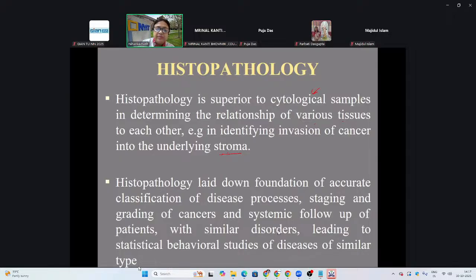Staining a tissue is a much more complicated process, and that requires several more intricacies in order to be able to look at the tissue as such, or even the organ as such, and have it stained, and then tie it to staging, which we talked about, and to grading of the cancer. So everybody has to be in synchronization when it comes to this.